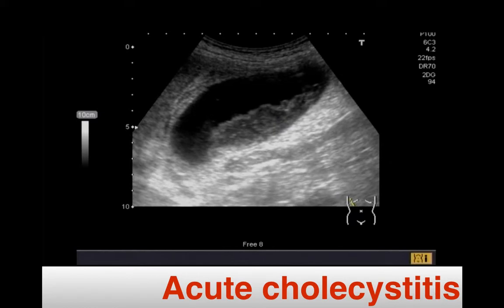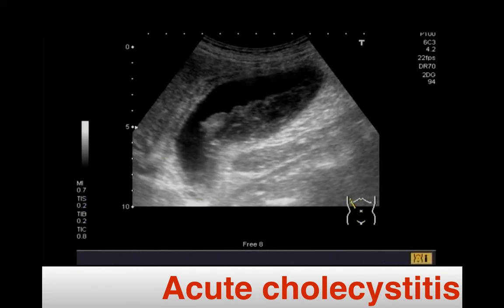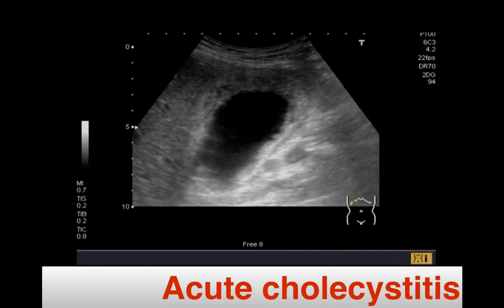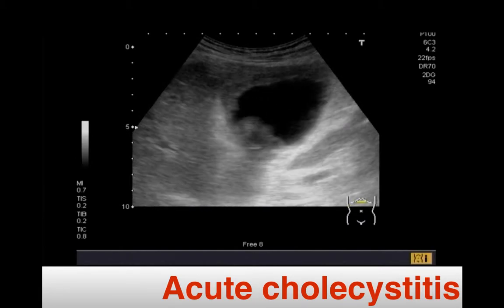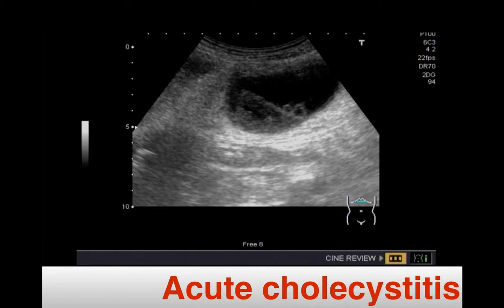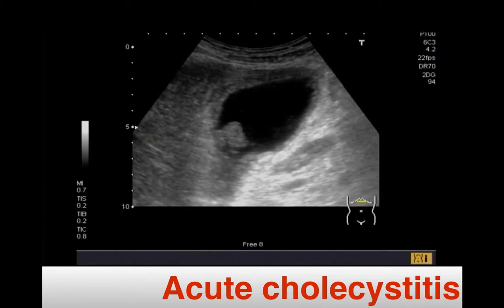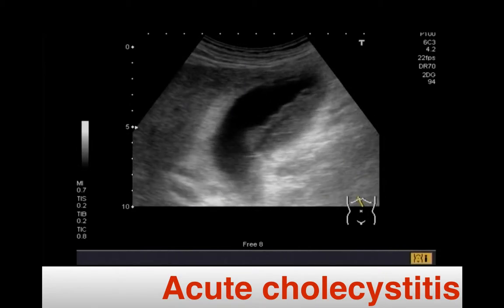And in severe acute cholecystitis, you will have this kind of finding. The wall becomes thick and irregular in shape, and even tries to become gangrenous. Some black fluid around the gallbladder, and most important, you see the probe on the gallbladder. When you put the probe in, you also elicit a positive echo-Murphy sign. So stone, distended, thickening, positive echo-Murphy sign. The diagnosis is very clear.